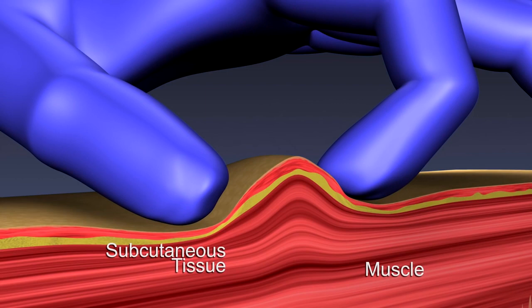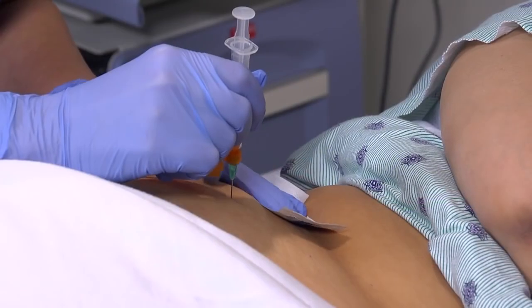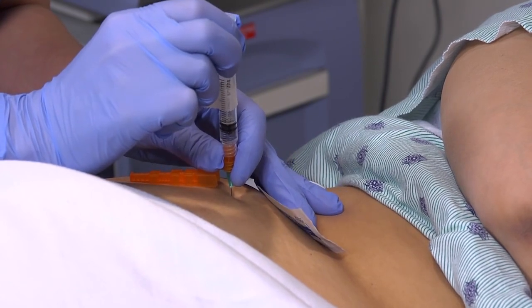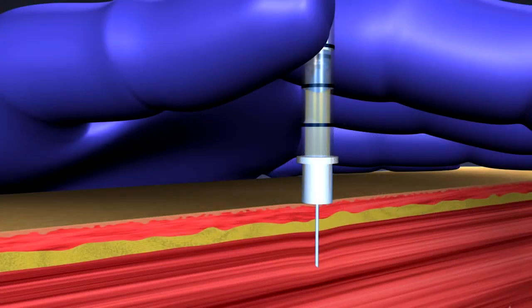With your dominant hand, quickly pierce the muscle at a 90-degree angle to the skin. Continuing to pull the skin taut with your non-dominant hand, stabilize the syringe by grasping the lower end of the barrel with the fingers of the non-dominant hand as they are resting on the patient. Attempt to aspirate by pulling back on the plunger with your dominant hand. If blood appears, you're not in the muscle. Remove and discard the needle and syringe and start over. If no blood appears, you're ready to proceed.